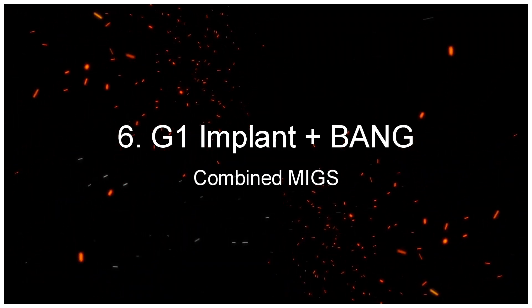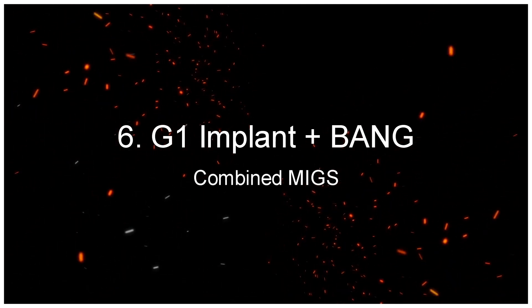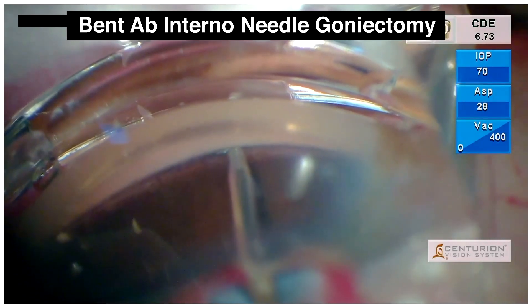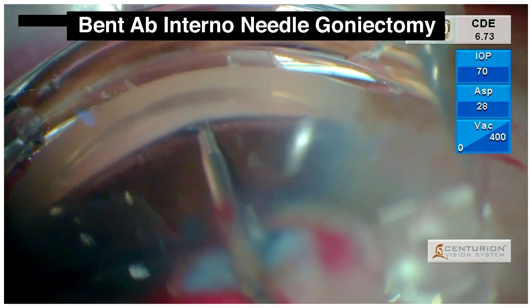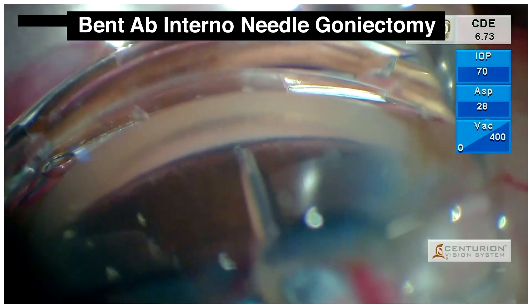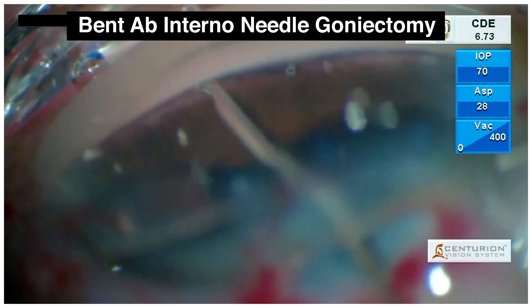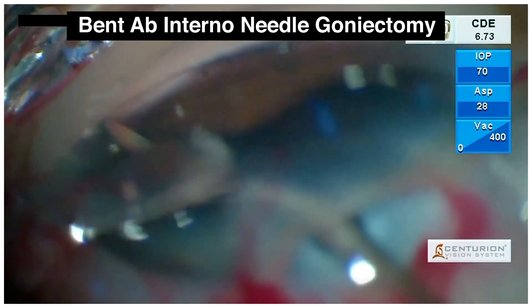The G1 Implant Plus BANG — Combined MIGS. Similarly, in this case, with the implantation of a G1 iStent, an additional MIGS procedure was done. Here we performed a bent ab interno needle goniectomy on either side of the implant, at least one clock hour apart, to ensure additional outflow via the trabecular meshwork.